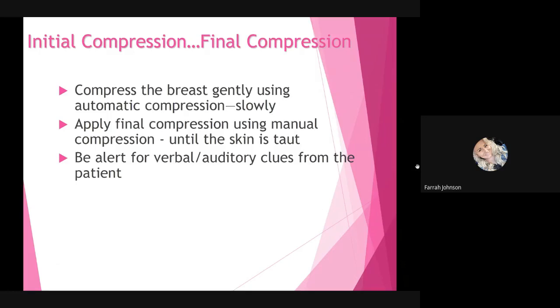So, the initial compression to the final compression. You want to compress the breast gently using automatic compression with your foot pedal slowly. You want to apply the final compression using the manual compression mode, which is going to be the turn dial on your machine. And you want to do that until the skin is taut.